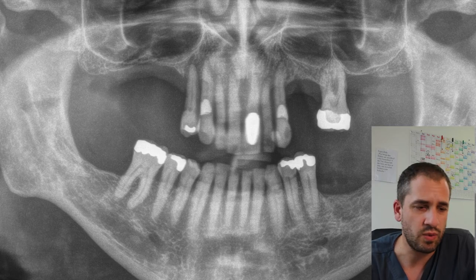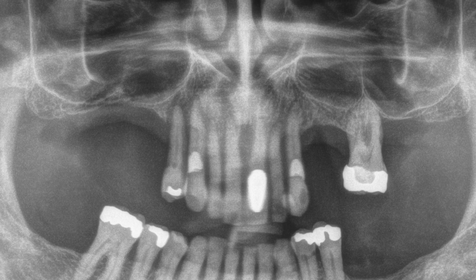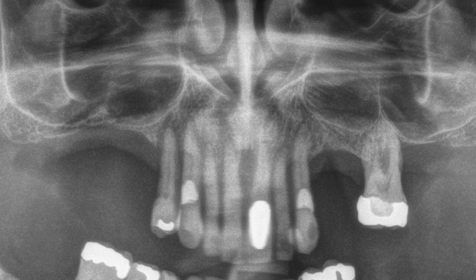As you can see as well, there is a severe loss of bone — only a few millimeters of bone at the sinus floor. We planned to extract the teeth and to place implants in one procedure using allograft rings.